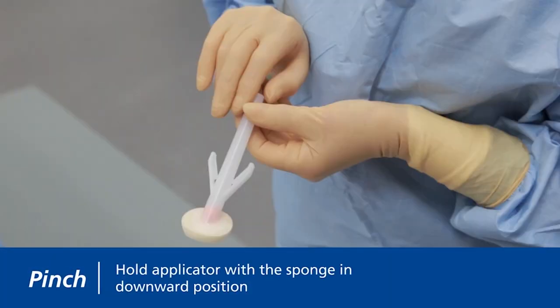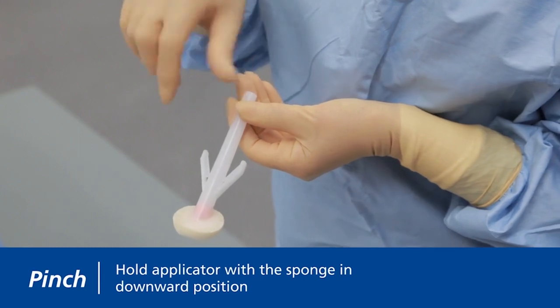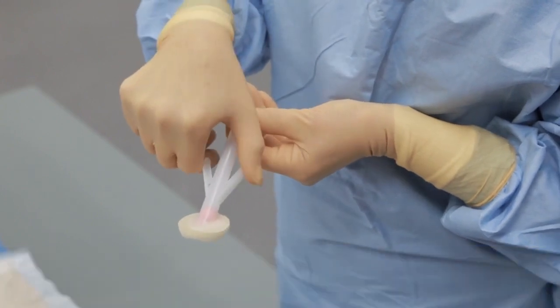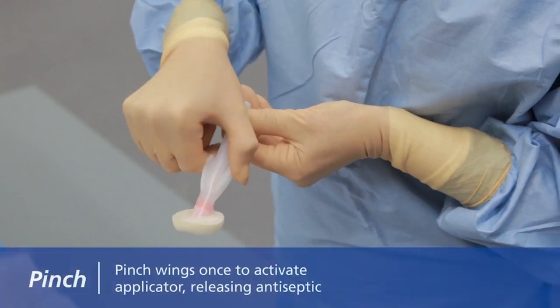Now, activate the applicator by holding it with the sponge in a downward position parallel to the ground and place the wings between your thumb and forefinger. This position allows the solution to properly load into the sponge upon activation. Pinch the wings once to activate the applicator. You will hear a pop as the ampule breaks.